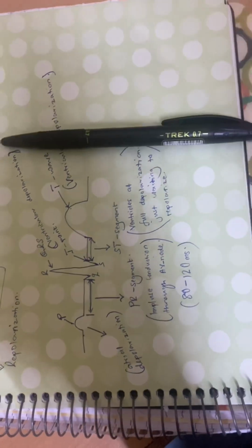You calculate the time, PR segment time. If it's prolonged, probably PR interval is prolonged.